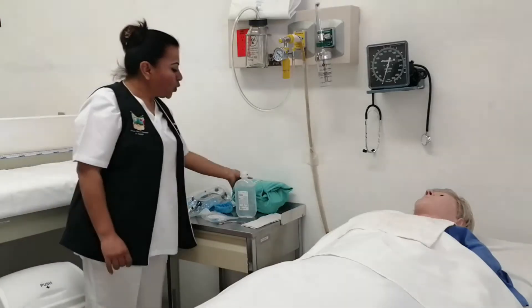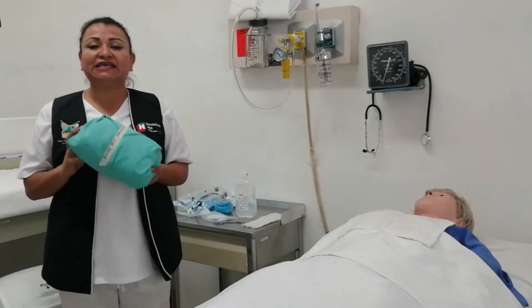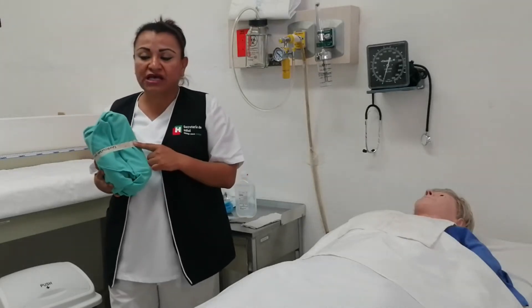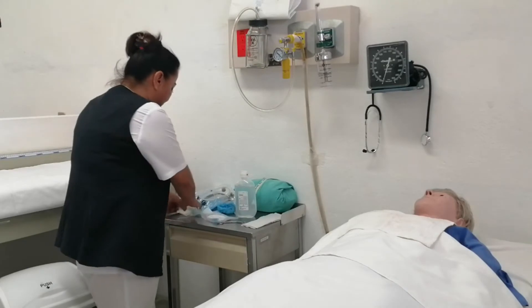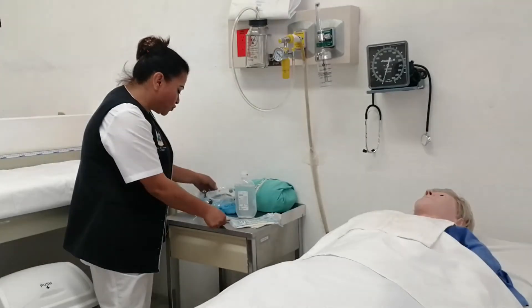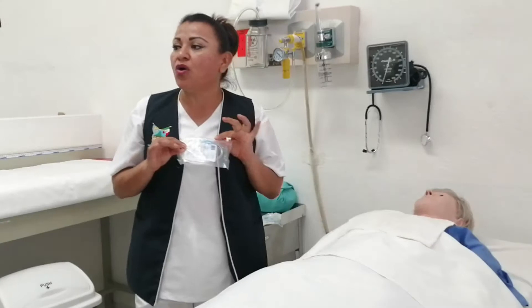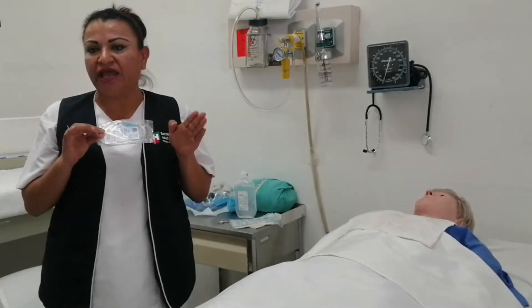Vamos a utilizar un equipo para la aspiración de secreciones, el cual tiene que ser estéril. Como personal de enfermería tenemos que verificar la fecha de proceso y su fecha de esterilización. Necesitamos un par de guantes desechables estériles y una sonda de aspiración de secreciones que, para el paciente adulto, puede ir desde calibre French número 12, 14 o 16.